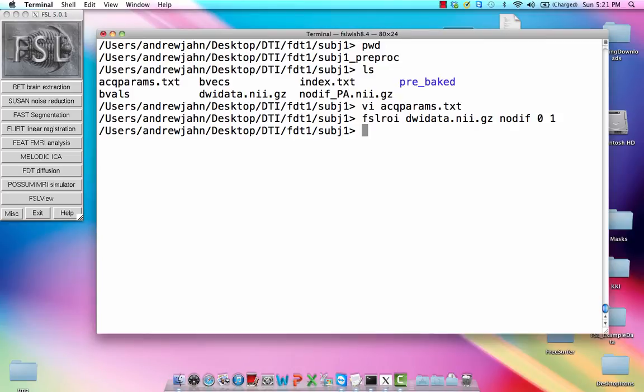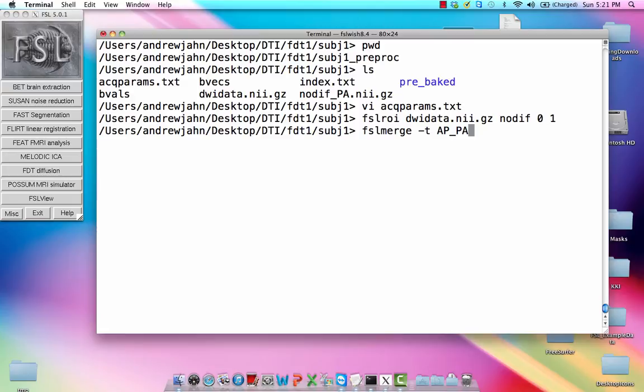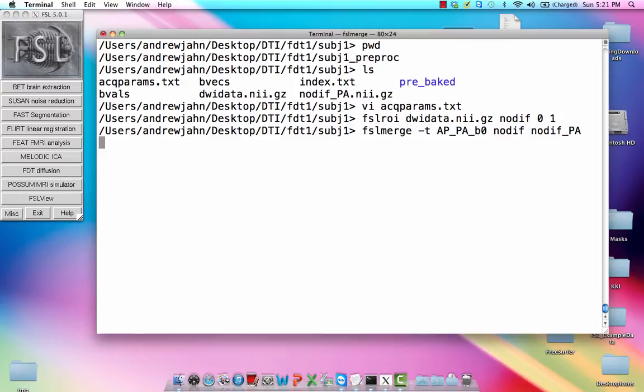Once we have those, we're going to merge those together using FSL-merge, and we're going to call this anterior to posterior underscore posterior to anterior B-naught, which is essentially our reference image. And we're going to combine no-dif and no-dif in the other encoding direction.